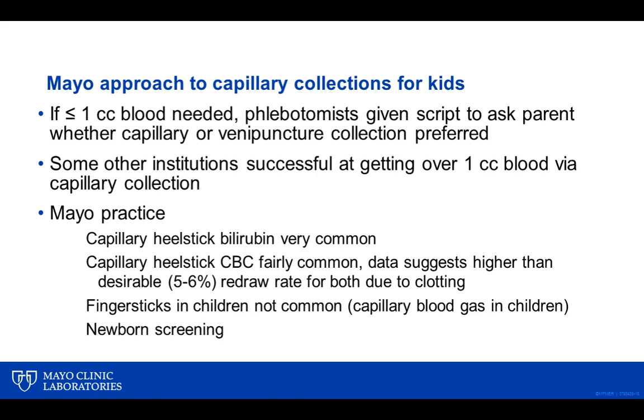In the end, what do we do in our practice? Well, most bilirubin testing in the nursery and as outpatient follow-ups in the first couple of weeks of life are done by capillary heel sticks. So we very commonly do total bilirubin by heel stick. Newborn screening is pretty much everywhere done by heel stick. We do a lot of heel sticks for CBCs in the nursery and in the special care nursery, the level 2 nursery. Again, our data suggests exactly what I've told you.